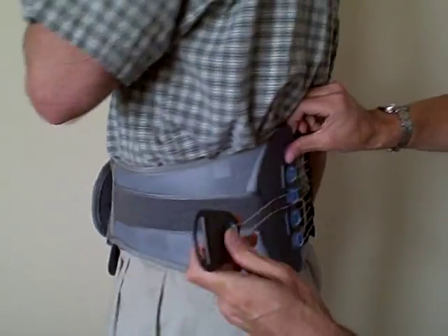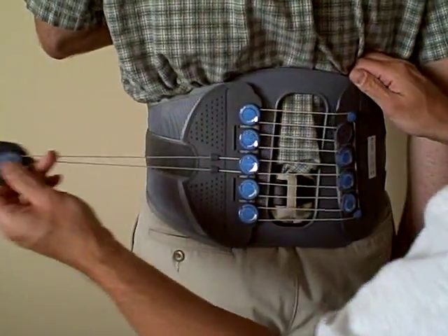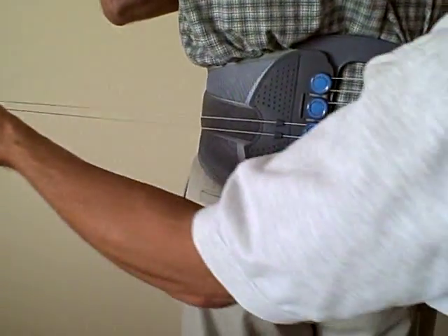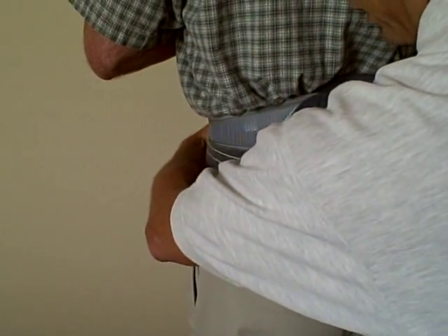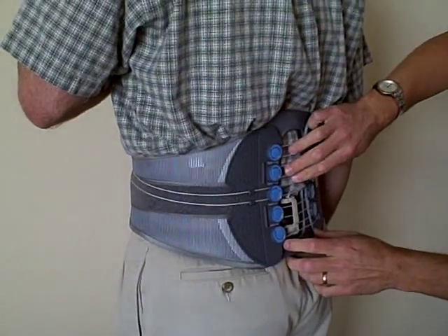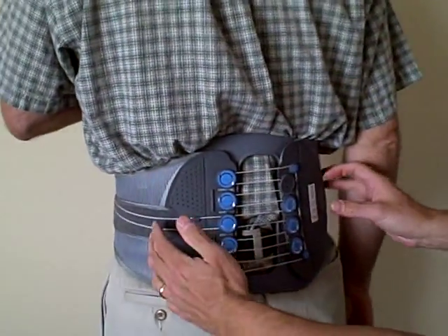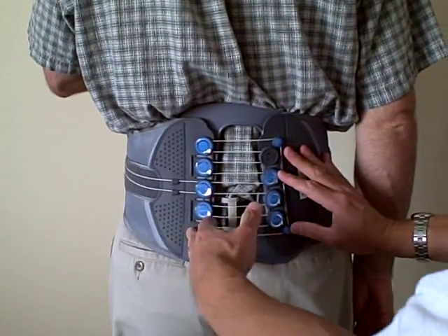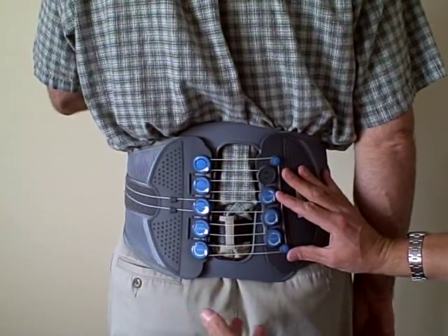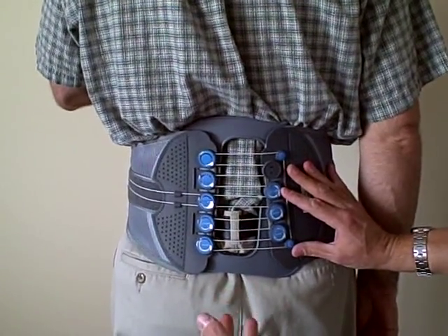By engaging the compression, what we're doing is utilizing the pulley on the back of the corset. This pulley will open and close. As we make it very tight, compressing the low back, what we're doing is supporting the low back muscles in the spine. Those muscles take the burden of supporting the spine. By providing this compression, we're taking some of that burden away from the muscles, helping them to relax, increasing the blood flow and the oxygen to the muscles, and that's what's going to provide relief for the patient.